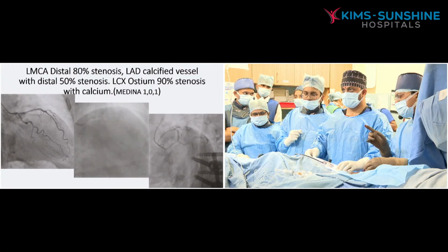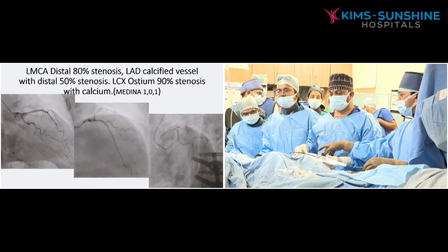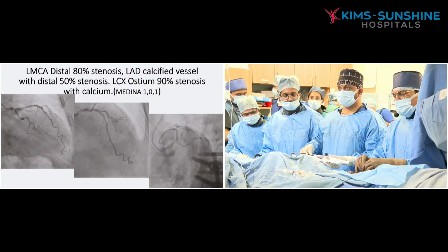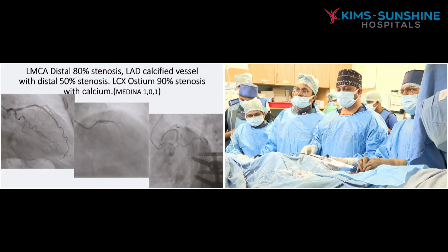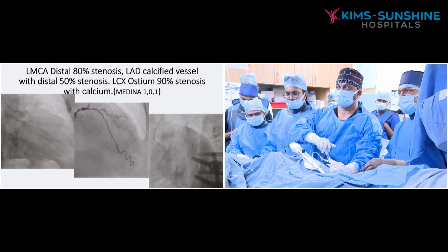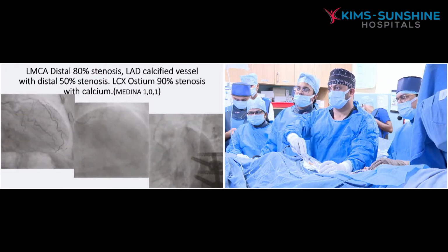If there is difficulty, you can switch on the Dynaglide and move it. Suppose if there is tortuosity, a bend is there, it's not going, just Dyna, both. Slightly pull the wire. Give a little injection. Inject. Now what we'll do, we'll park there, slightly disengage and we'll do it.